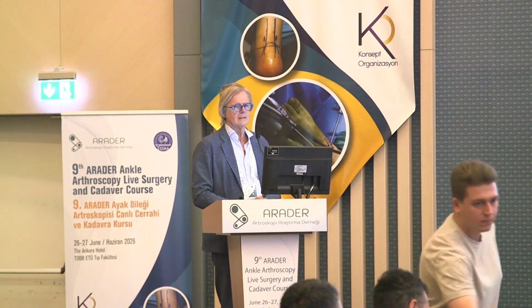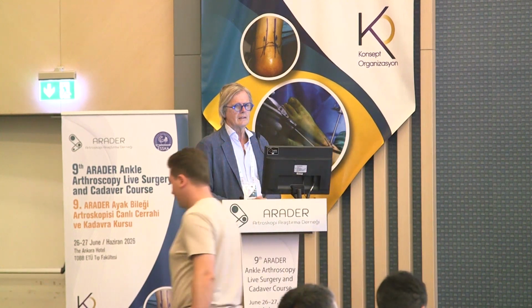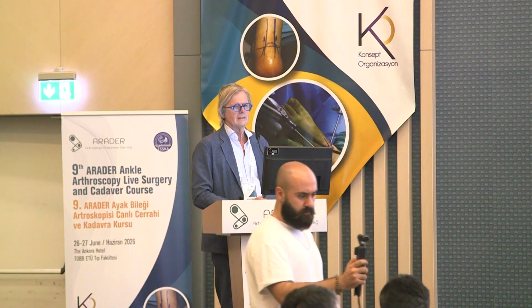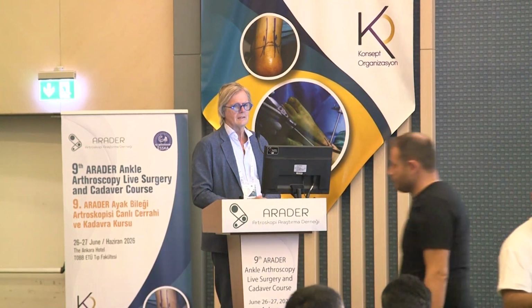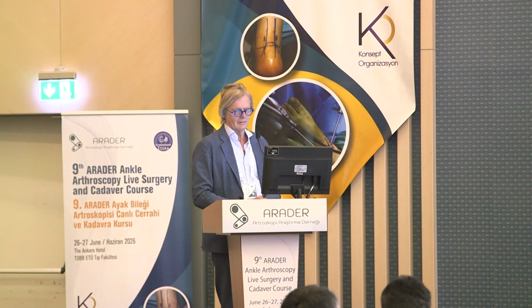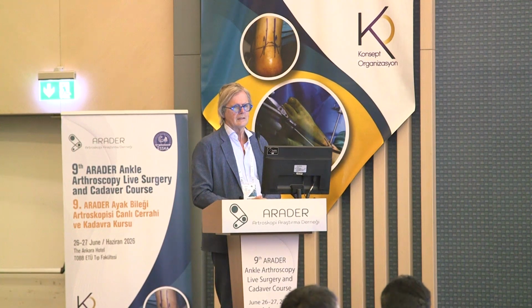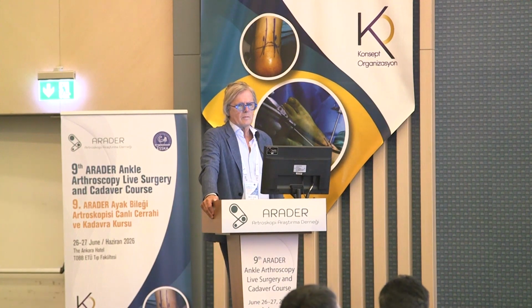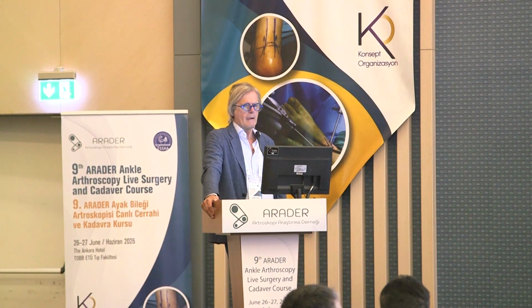Also, I think, if you would look at the very short-term results, if you would only take away the synovitis, you would probably have a few months of a window, very short, where you have a very good result, and then after 4 or 5, maybe 6 months, you will have the same complaints again, if you're lucky, because you can do a very quick procedure. I've never done it like that, to be honest.